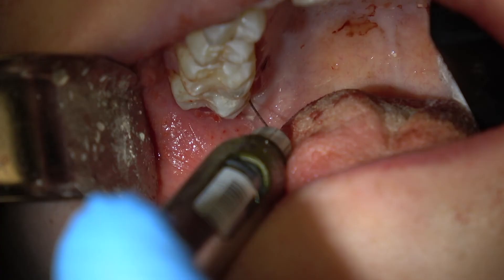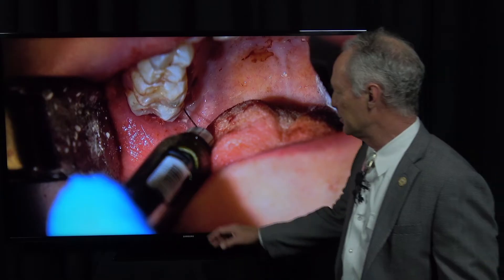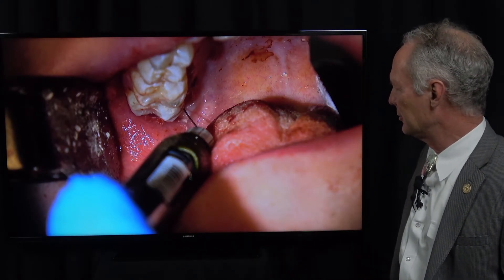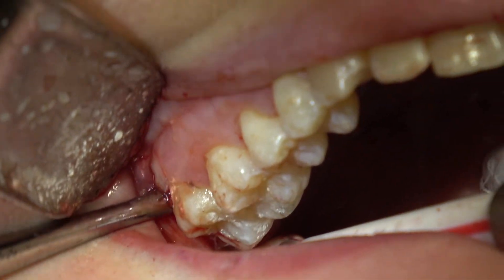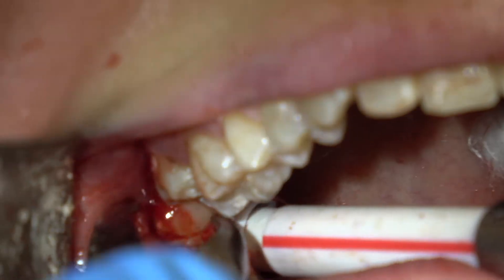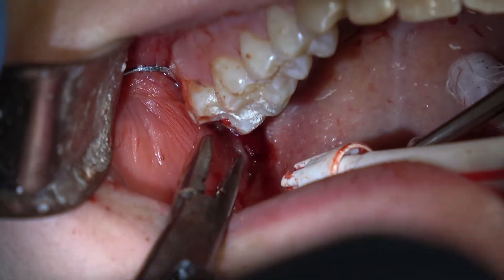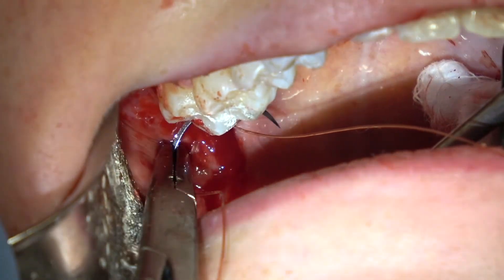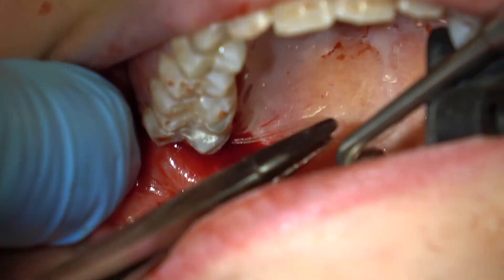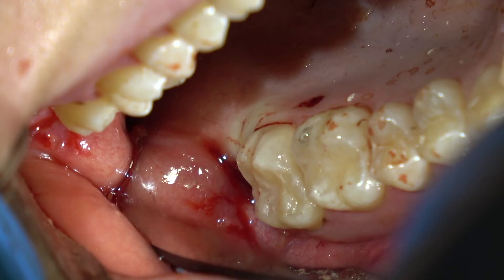I'm giving an intraligamental injection of the maxillary right wisdom tooth after an infiltration — the intraligamental is very important so the patient won't feel anything. Then I'm placing the elevator distal to the second molar and just rolling it right out. Be careful to protect the airway. I'm placing one 3-0 gut suture to suture the flaps of the maxillary extraction sites. Two sutures in the mandible, one each in the maxilla.